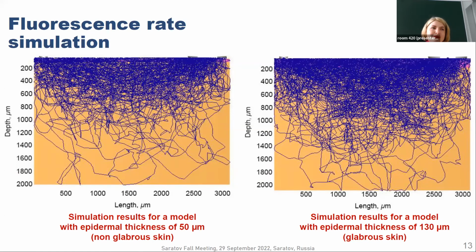Our assumption is that this is because of the higher thickness of the epidermal layer. In this case, the epidermal layer contains more fluorophores, which is taken into account.